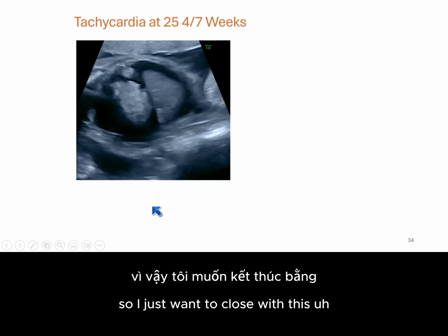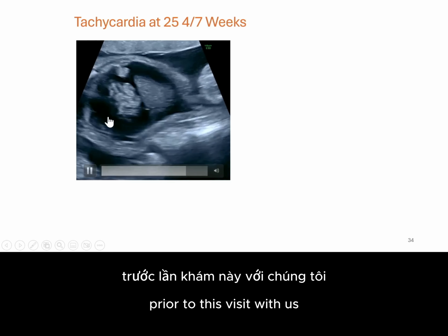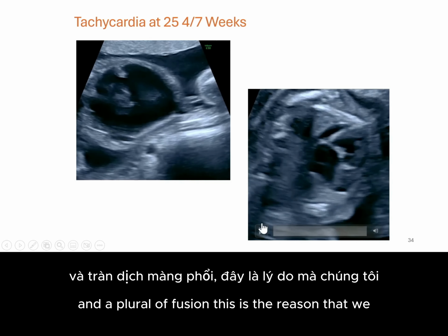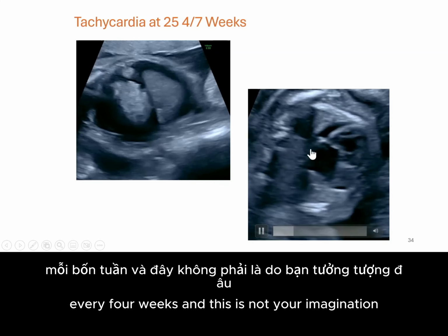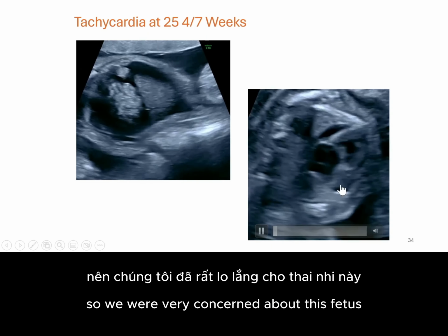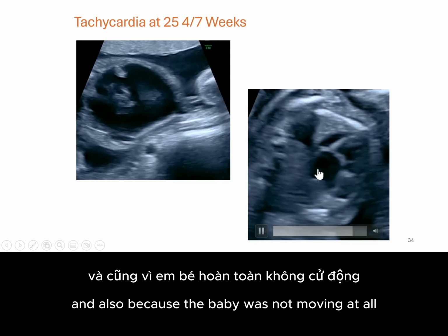So I just want to close with this picture of a fetus in tachycardia. This mother was seen 4 weeks prior to this visit with us, and I'll show you why in a minute. You can see there's a lot of ascites here and a pleural effusion. This is the reason that we saw her every 4 weeks, and this is not your imagination. This is the right ventricle here. This is a fetus with hypoplastic left heart. So we were very concerned about this fetus because not only of the tachycardia, but of the structural defect, and also because the baby was not moving at all.